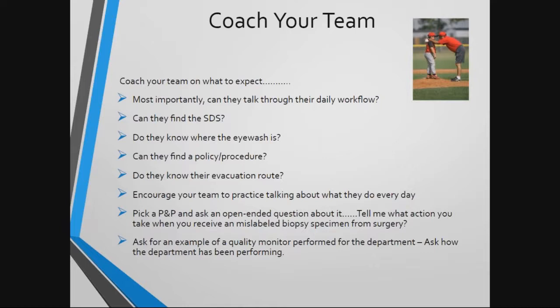Ask if they know what the compliance is for their frozen section turnaround time, for example. Perhaps ask what other quality monitors they're aware of that are being tracked and recorded for the department. Can they speak to them or can they give you an example? Coaching your team helps them to understand what is going to happen during an inspection. And it also gives them ideas of areas that they might need to refresh themselves on prior to inspection.